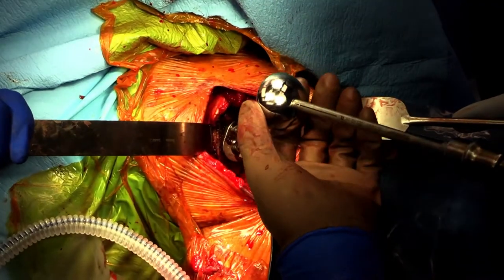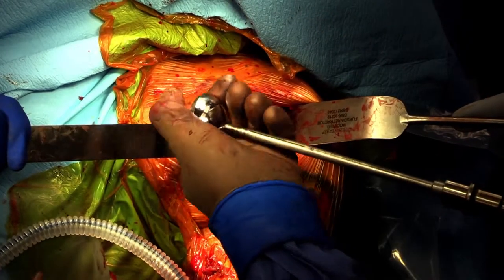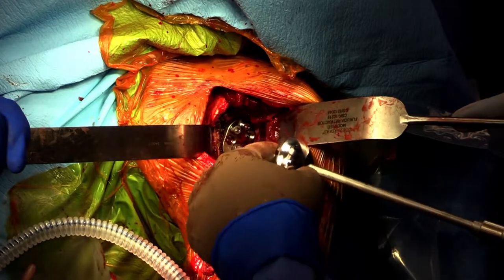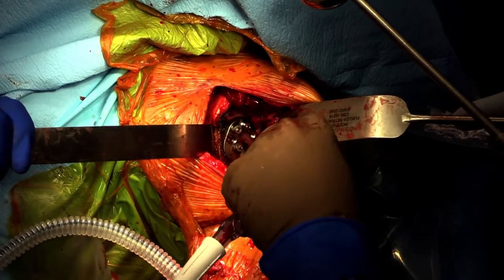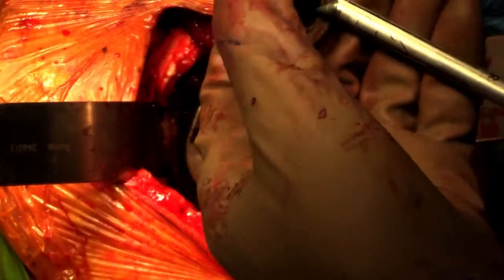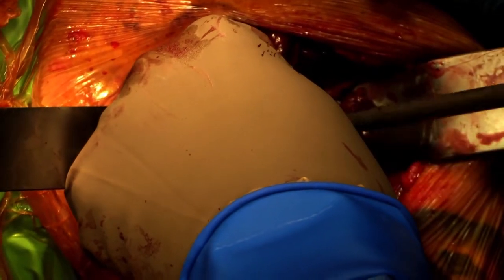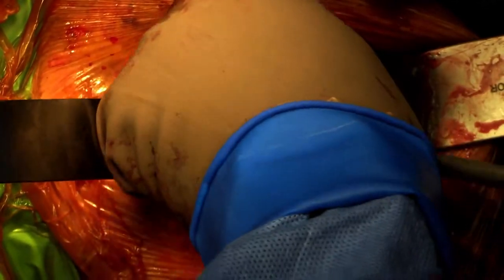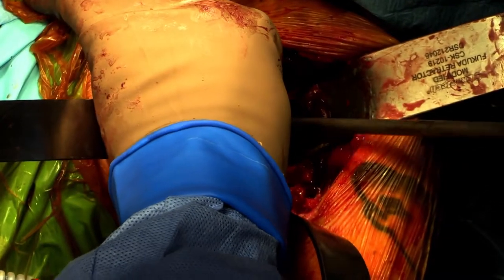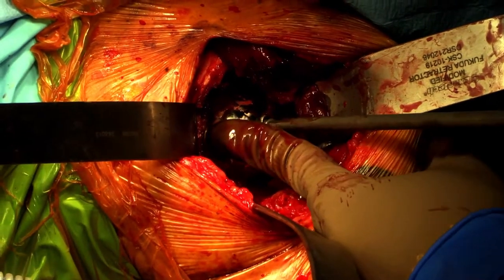There are multiple instrument options for the glenosphere insertion. In this case, the pilot-tipped inserter is made to engage into the center hole of the base plate to assist in alignment. Once the glenosphere is seated, apply digital pressure and insert the locking screw.